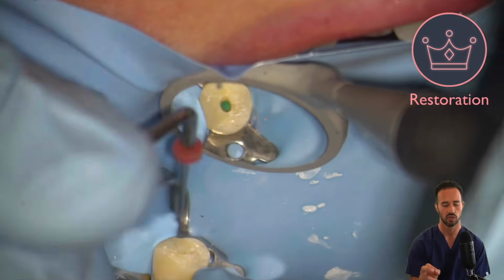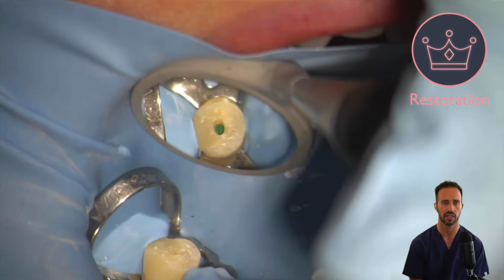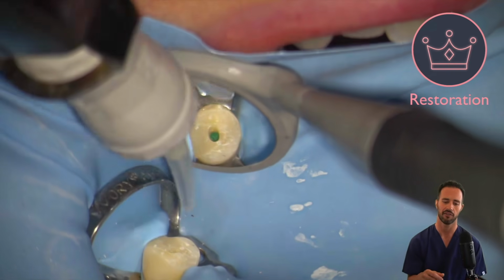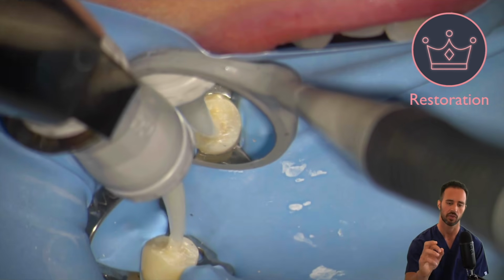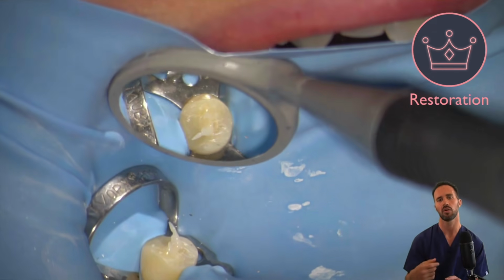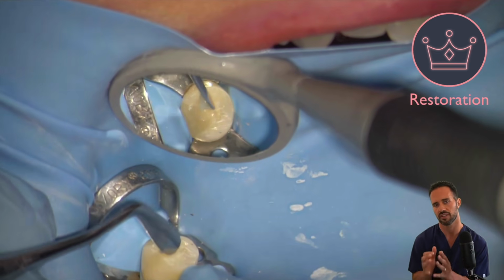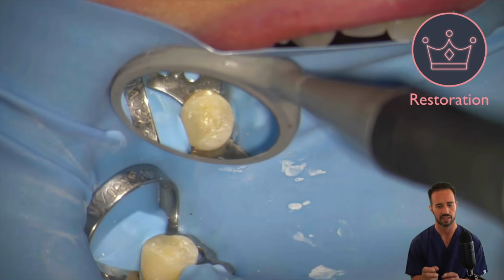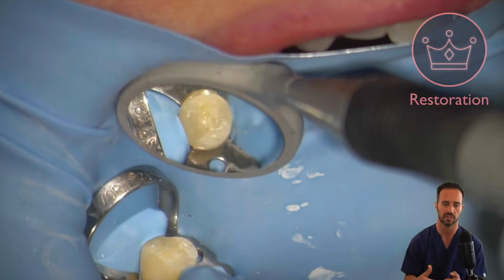All right. Also, if you're going to temporize the case, here's your green sponge that I've placed into the access opening. And for certain cases, I would recommend using a Fuji 9 glass ionomer, which is what I do here. And I do that in most cases, not all, but most, because it's a little bit of a stronger temporary restoration. It's going to give your restoration a little more strength. It's going to minimize potential contamination if there is some leakage of the temporary.